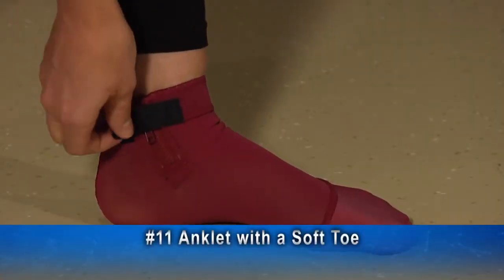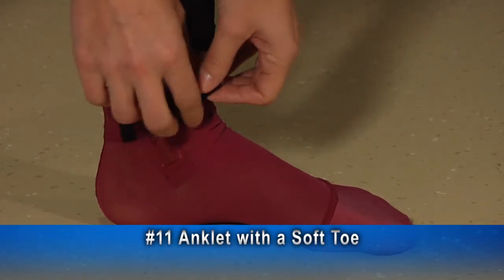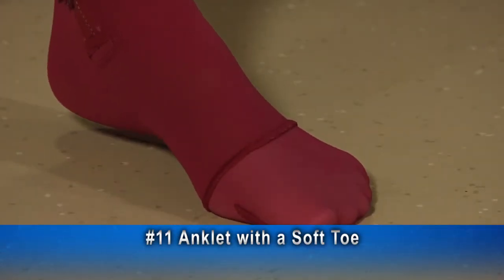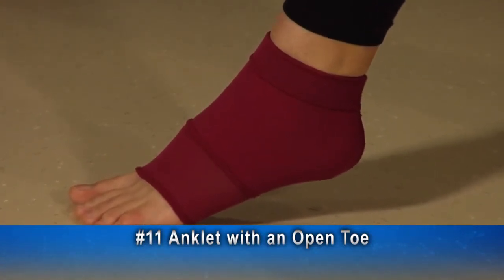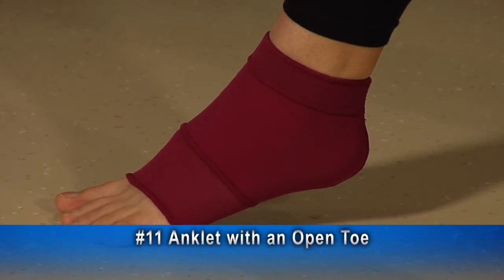This is a number 11 anklet with a soft toe, medial zipper, and a Velcro tab to keep the zipper from opening. In the soft toe option, the toe box is made of a soft lining material. There is a seam around the foot joining it to the rest of the garment. The number 11 shown here is an anklet with an open toe and a full ankle lining. In the open toe measurement, the stocking ends at your last circumference measurement.